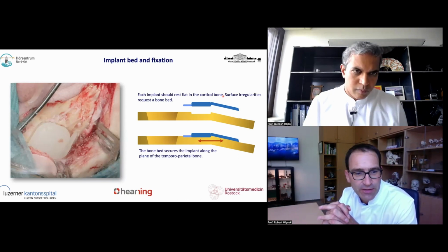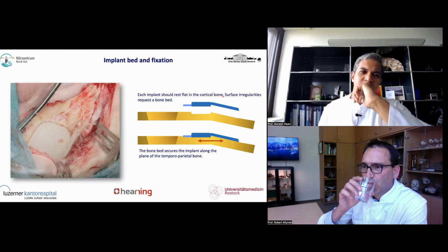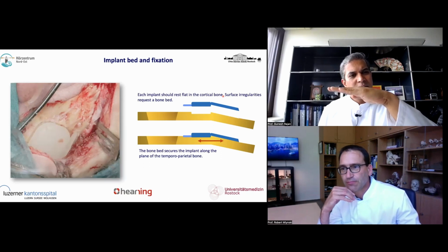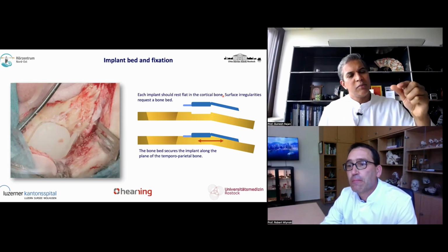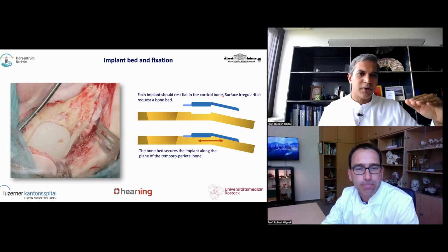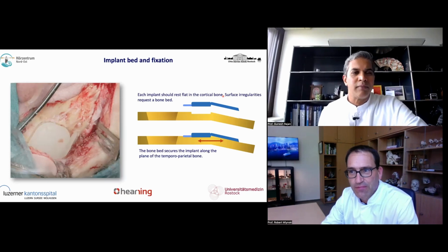the indentations. Are you using pin implants at the moment? No, not really. I'm just concerned, with the pins you place the implant on the bone, right? And then I'm concerned about what happens with the lead, because if that stays on the bone as well, you have all this risk of shearing injuries, the micro shearing over time, which can lead to implant failure.